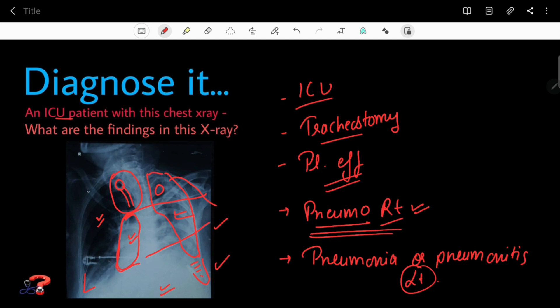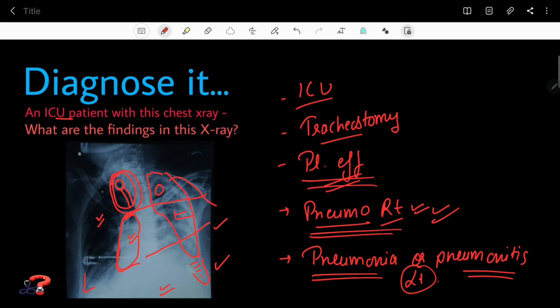To summarize the findings: the tracheostomy tube is displaced from the central position, indicating significant rotation in this X-ray. On the right side there is pneumothorax — air present between the two layers of pleura. On the left side there is pneumonia or pneumonitis, blunting of the costophrenic angle indicating pleural effusion, and ECG leads confirming the patient is in the ICU.